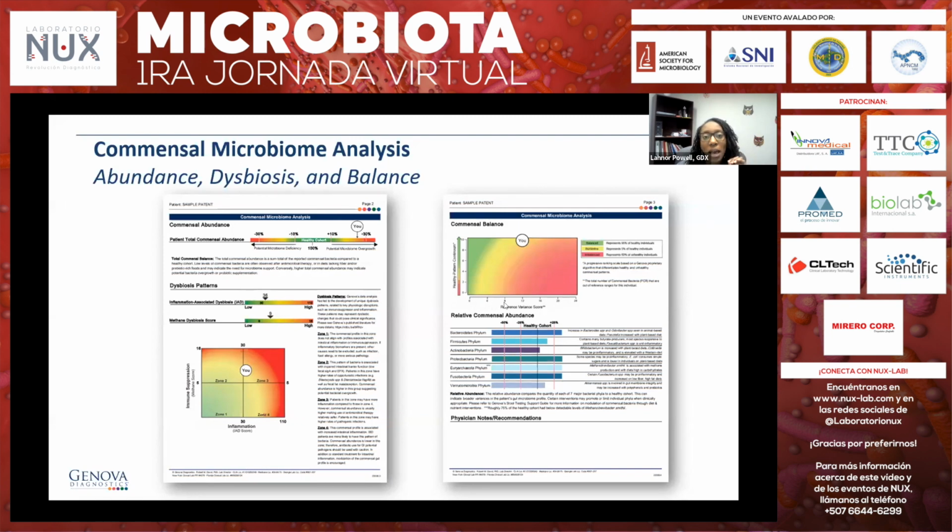The balance is the intersection of two different measurements, the reference variance score. So that tells you out of 24, how many anaerobic bacteria are out of range. And then the healthy pattern continuum, the higher the number, the more you fall in alignment with our healthy individuals. So we want this result, or the U bubble, to be in the green zone.